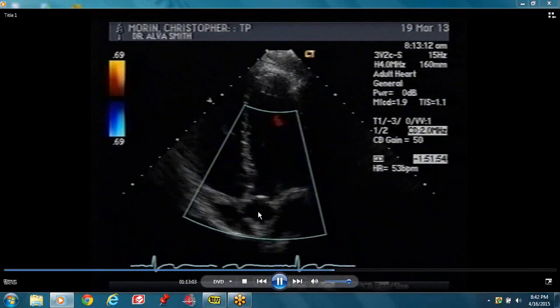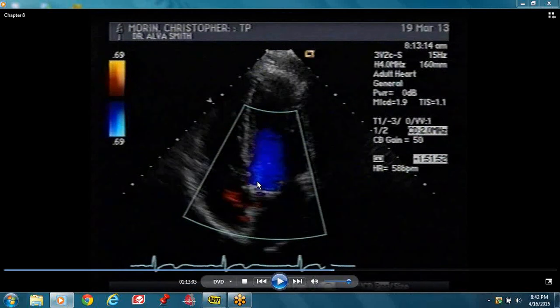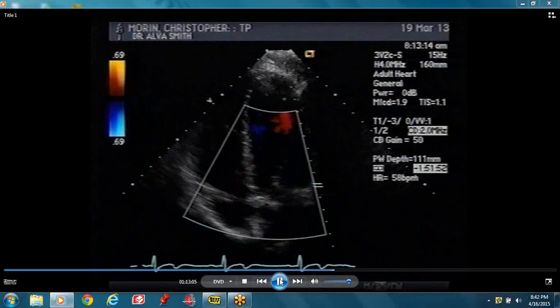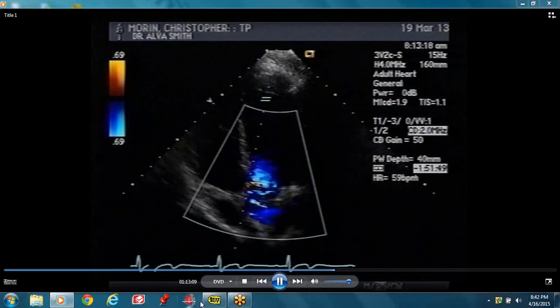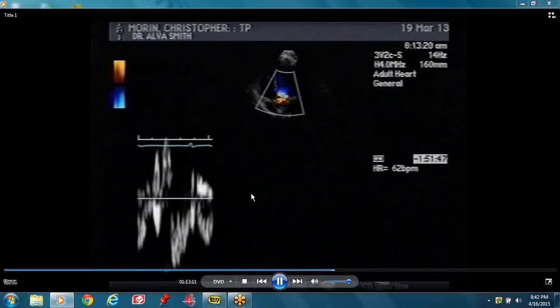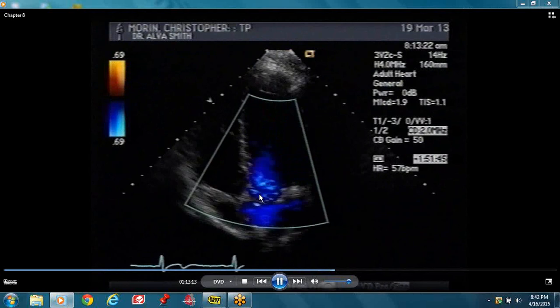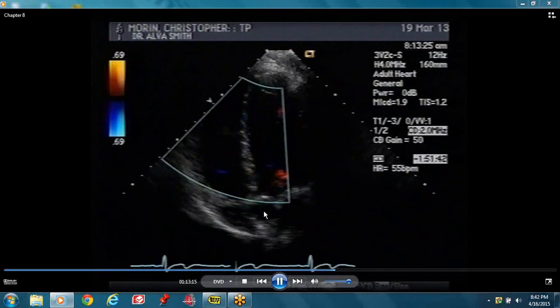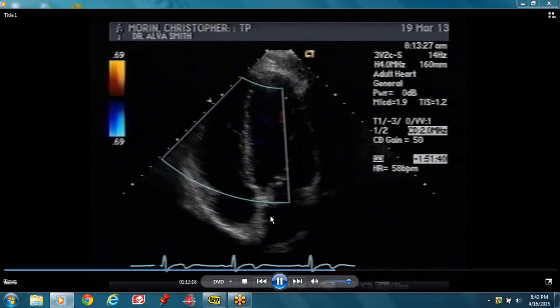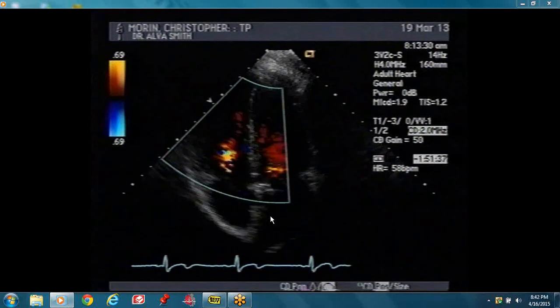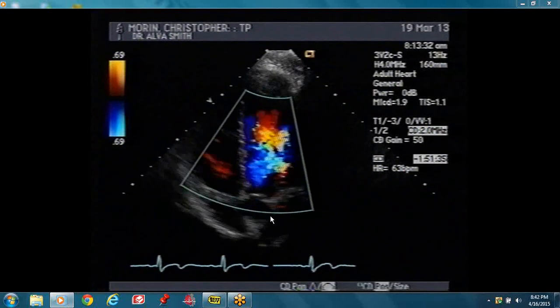This is our five chamber view. With the five chamber view, you can see the aortic valve is opened. By doing that, you change the orientation so you can also see the moderator band in the RV. You can see the moderator band right over there. This is the aortic valve and you put the color flow looking to see if there's aortic insufficiency. You can see turbulence as well.